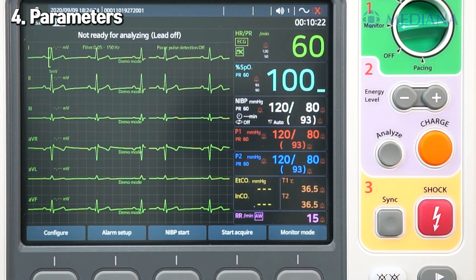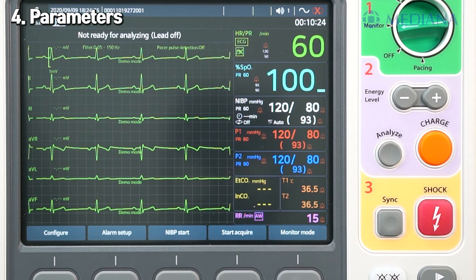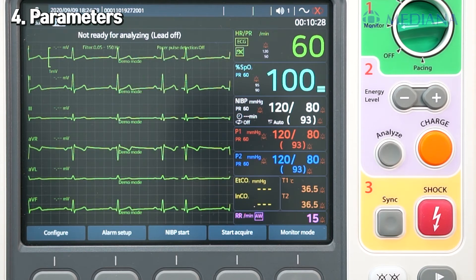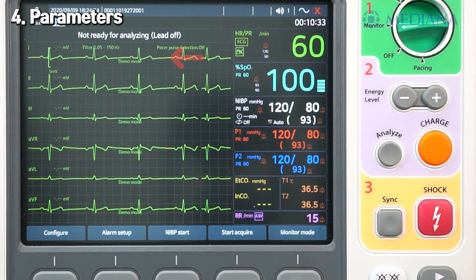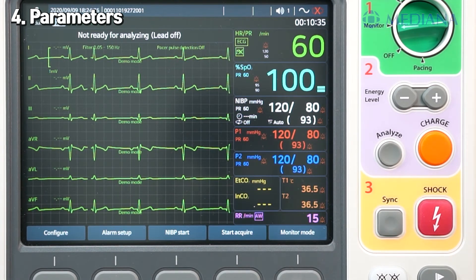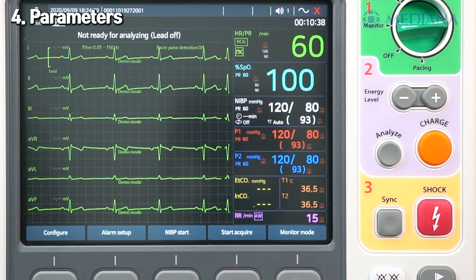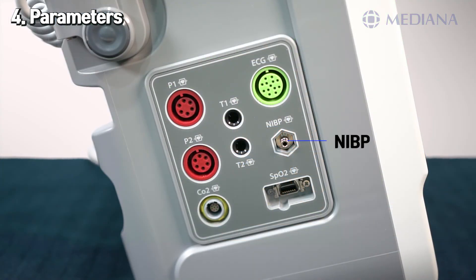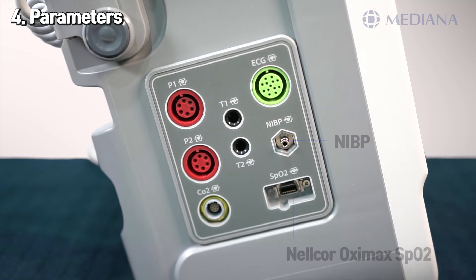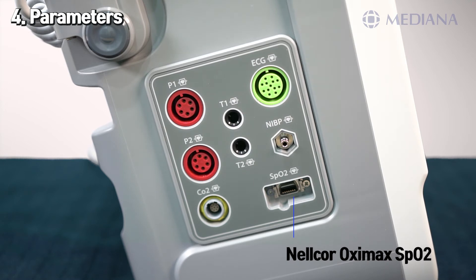A STEMI is a serious type of heart attack during which one of the heart's major arteries is blocked. After measuring ECG, the PQRST waveform shows up on the screen. By using this algorithm, we can detect abnormal heart movement by examining segments of the waveform. The IBP module is a world-class module from A&D Medical, manufactured with 40 years of expertise, making the device reliable and accurate. The SpO2 connector uses Nellcor or Mediana SpO2 sensors.